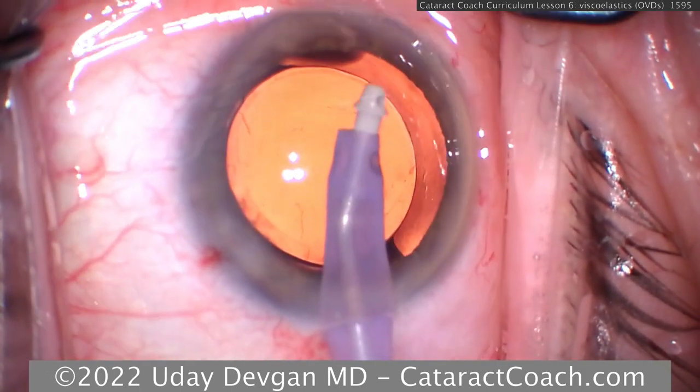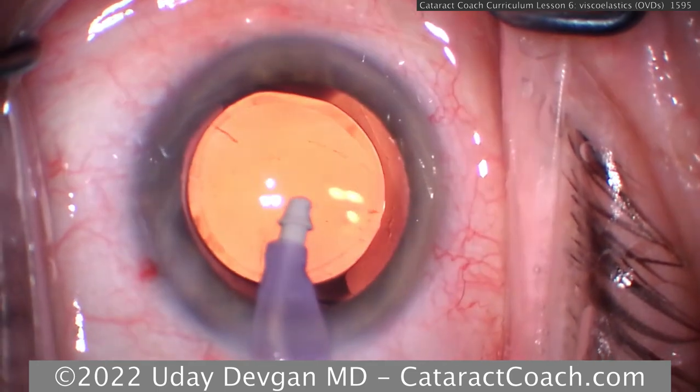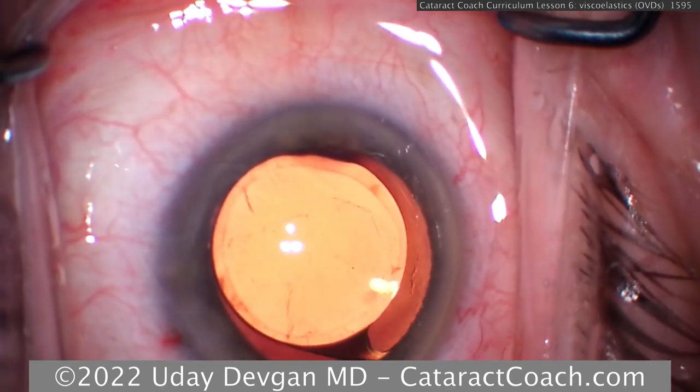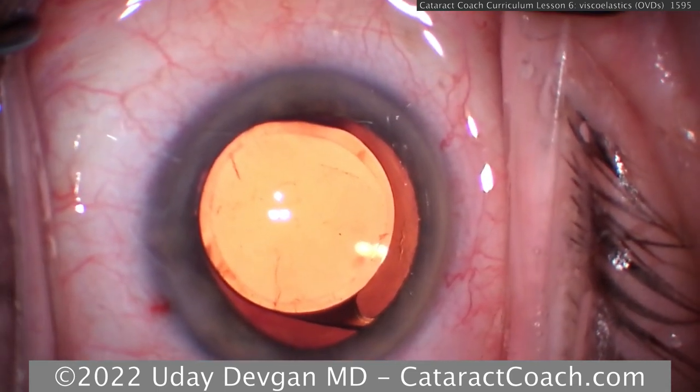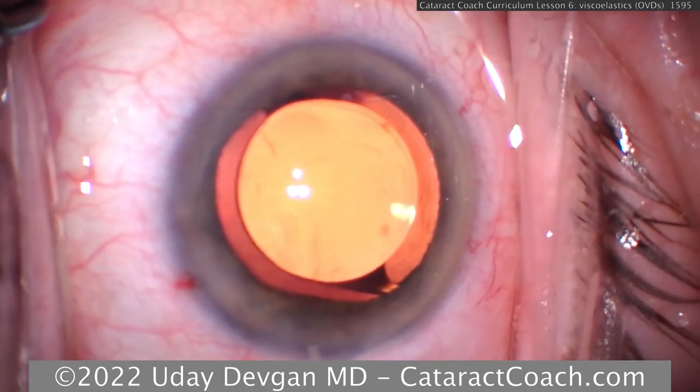The ideal viscoelastic characteristics for each step of the surgery depend on the surgeon's preferences. And you may find out, like me, I'll use a dispersive throughout most of the surgery and then just cohesive at the very end to fill the capsular bag for the IOL.